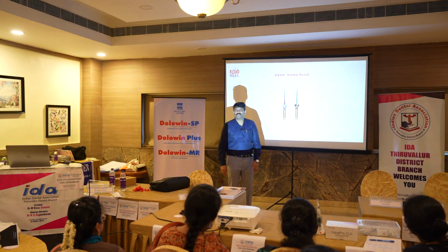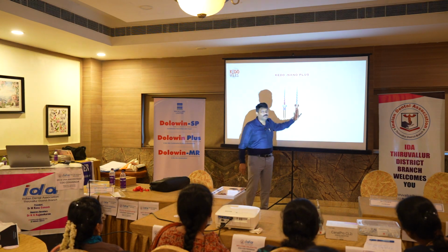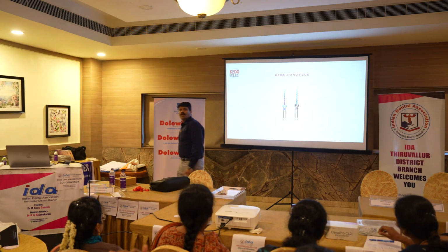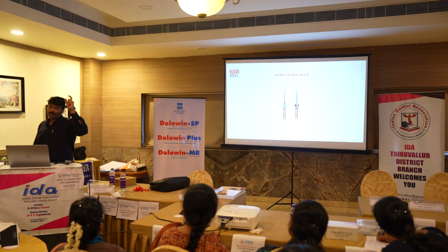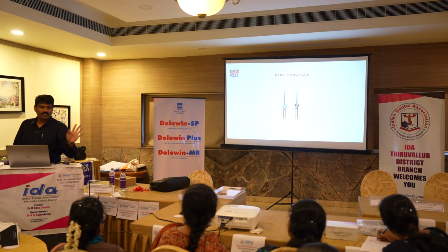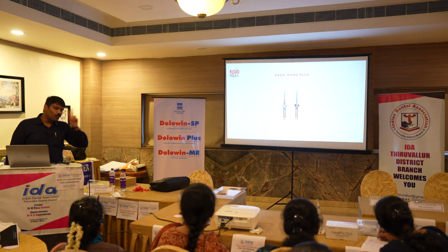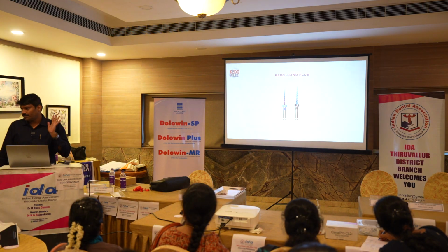It will not come. Use the black file. Consider that as an anterior canal. Use the black and finish the preparation. Understood? Especially in children less than 5 years old, your palatal canal is like your anterior. Simple application. With these 2 files, irrespective of whatever age, the pulpal tissue will come.